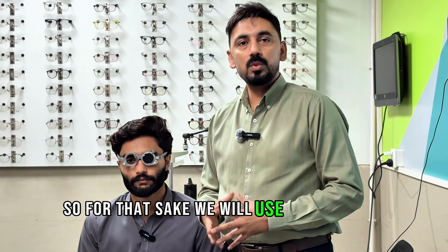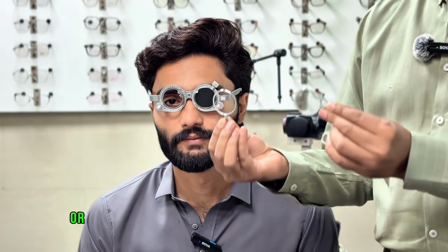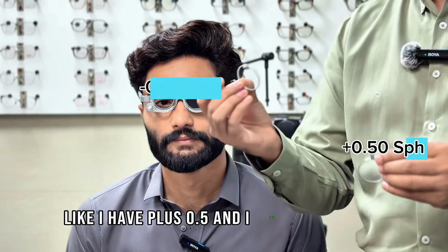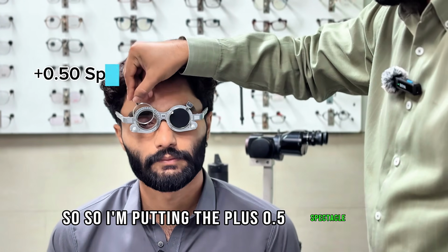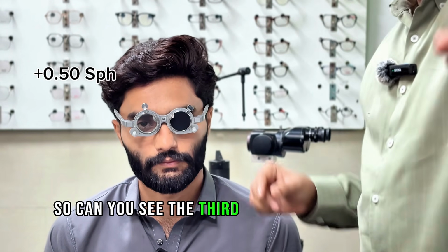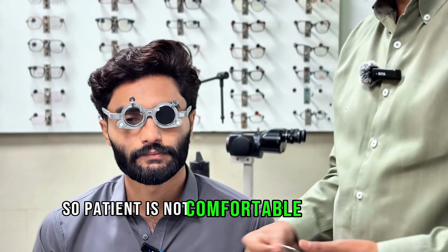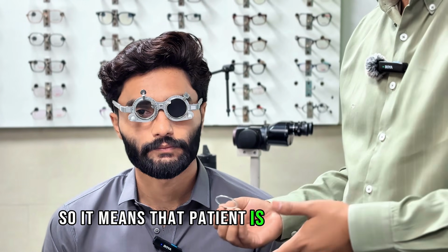For that sake, we will use the probe lenses. And what are the probe lenses? I have the probe lenses or trial lenses of the same power, like plus 0.5 and minus 0.5. So I'm putting the plus 0.5 spherical. Can you see the third line properly or not? No, it's not good. Right. So the patient is not comfortable with the plus lens, which means the patient is not hyperope.